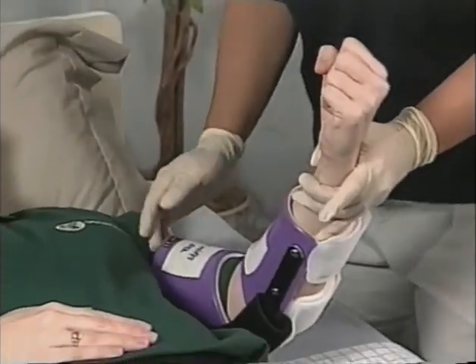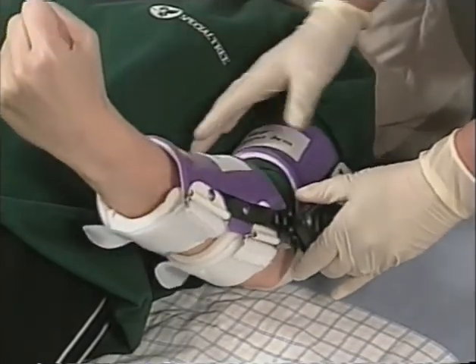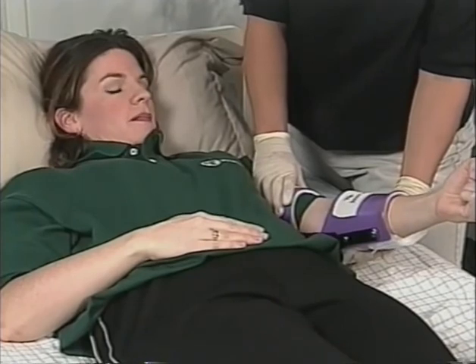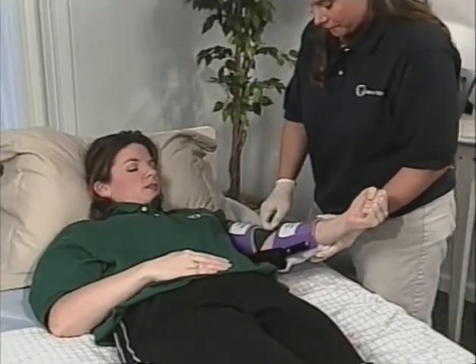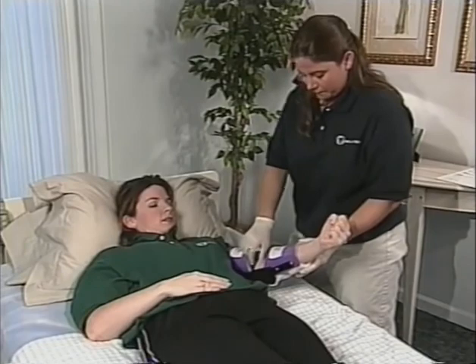After all adjustments are made, unlock the orthotic. For a final check: straps are secure, orthotic joint matches with client joint, no pinching is noted, and clothing is not wrinkled or bulky underneath, possibly causing pressure marks.